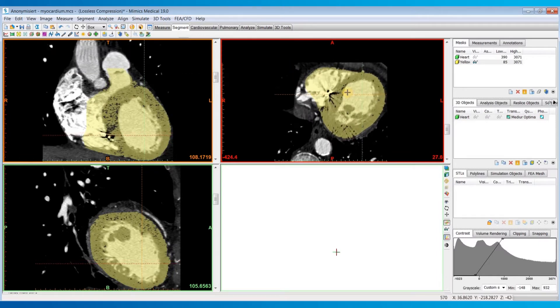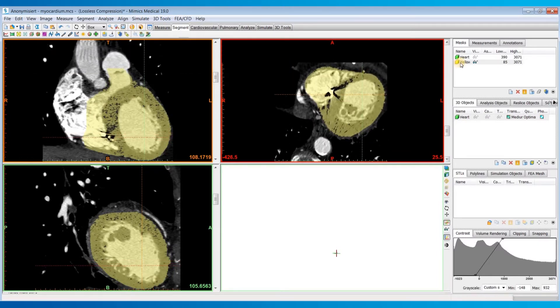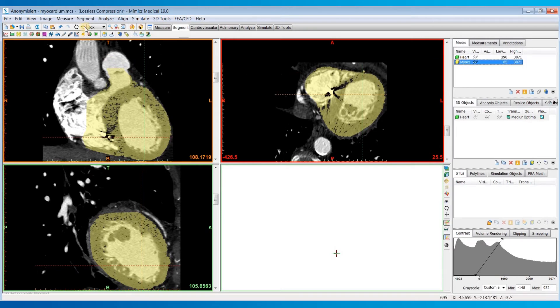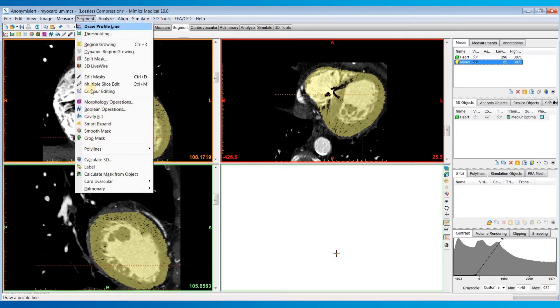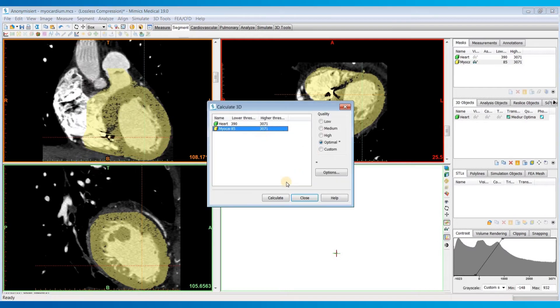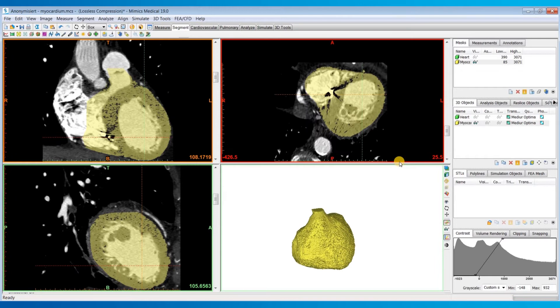Once you've created that mask, I'll rename it Myocardium, and then I'll go back to the segment menu and choose Calculate 3D to calculate the 3D object. Once it's done calculating, I'll then bring it over to 3Matic to do some smoothing and add it to the hollowed heart model.